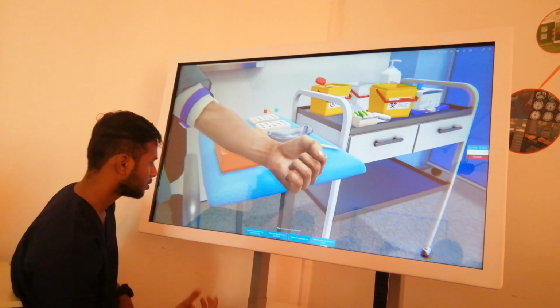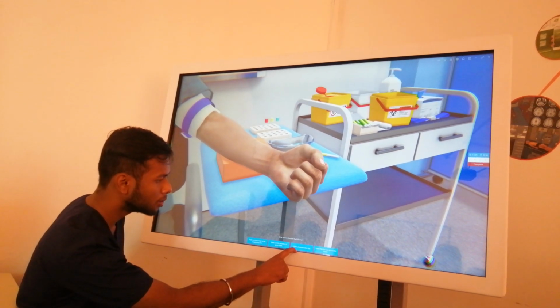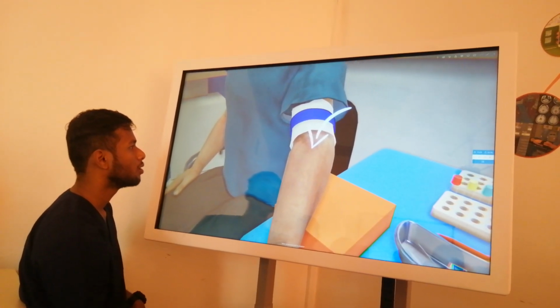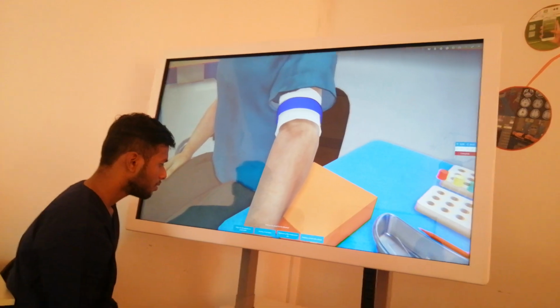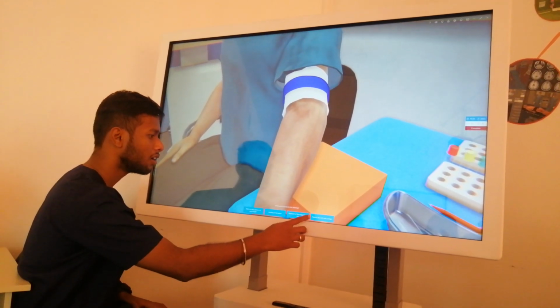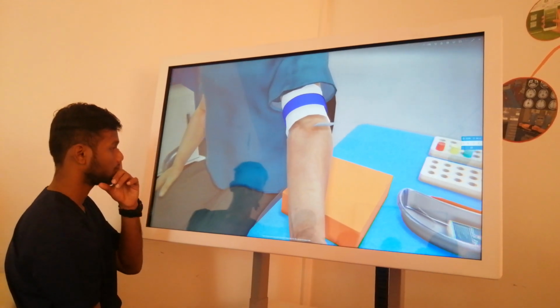What process should be the following? Apply an alcohol wipe to the venipuncture site, make sure the patient is in good health, choice of venipuncture site, insert the tube into the needle holder. Select the puncture site by palpation. What process should be the following? Make sure the patient is in good health, labeling of test tubes, treatment of the venipuncture site, fixation of vein with the finger. Treat the puncture area with an alcohol wipe. Wait for the alcohol to evaporate.